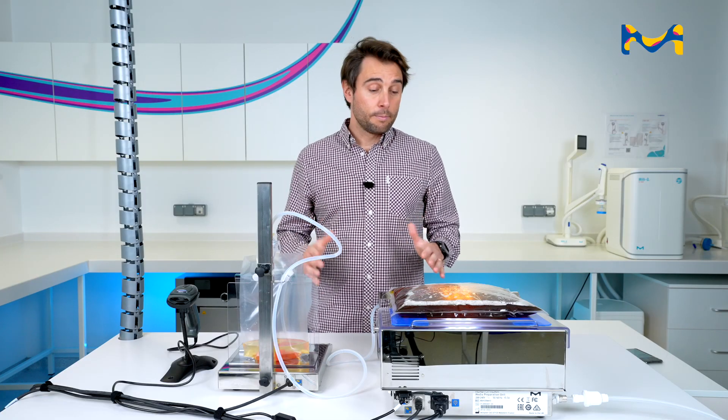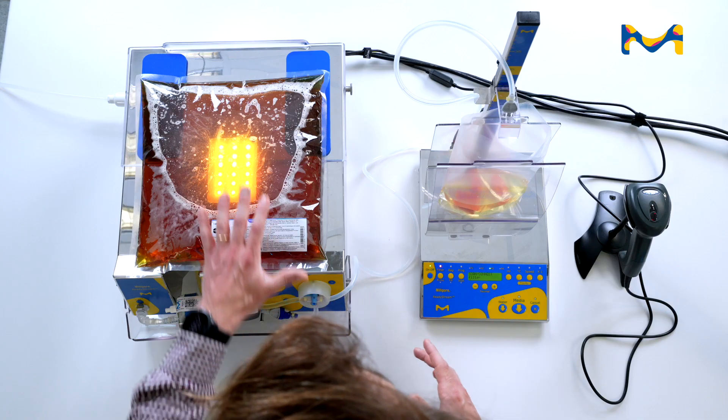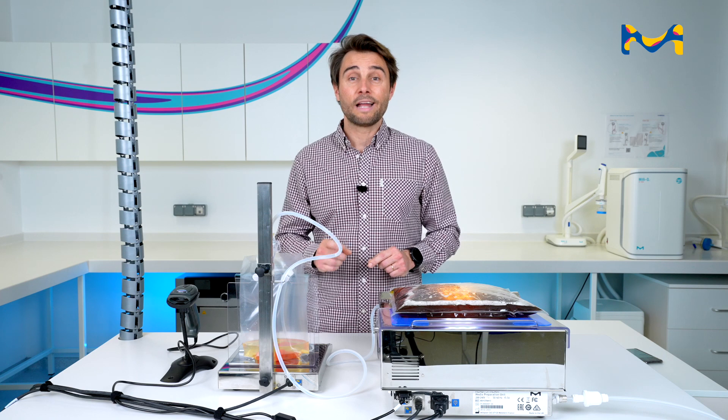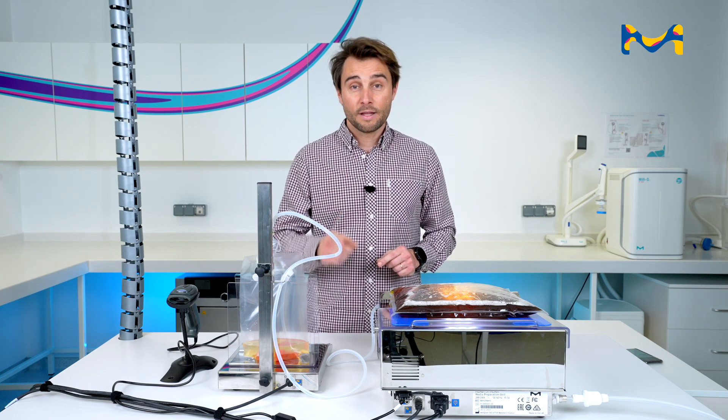So finally, what is ReadyStream? On one bench, you have up to 100 liters of buffer peptone water — sterile culture media at the temperature you want, at the concentration that you want. This is ReadyStream.